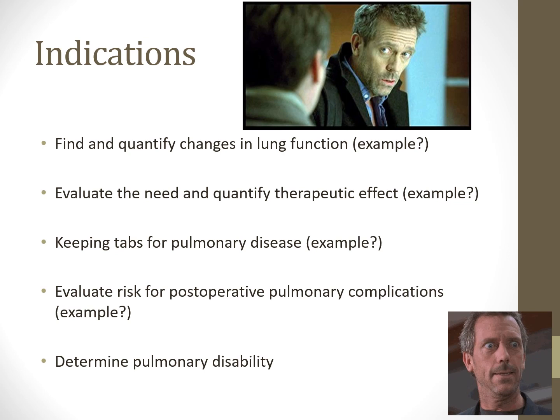We can also evaluate the risk for post-operative pulmonary complications, especially if they're not taking deep breaths, or if, say, someone's going to go in for a bariatric surgery. After they breathe very shallowly after surgery, right, are they going to be able to take enough deep breaths? Are they going to have enough lung function capabilities to recover from a general surgery and not get a pulmonary infection that could cause them to pass away, right? So we can mitigate risks of postoperative pulmonary complications by doing a pre-procedure PFT. And we used to do this quite a bit when I was working in the PFT lab.